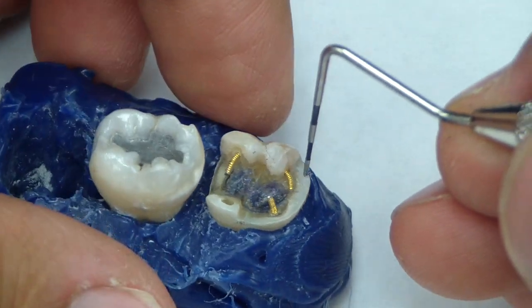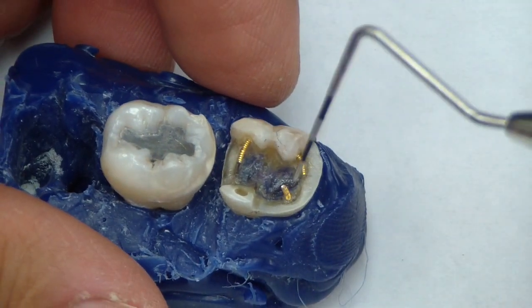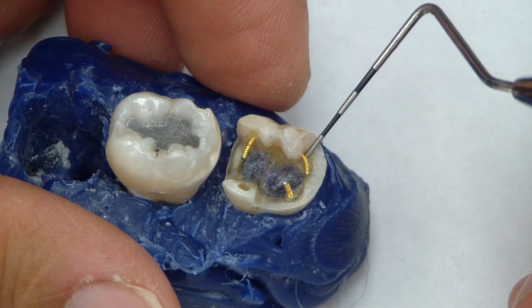You can also place some grooves — a whole bunch of different retentive features that can be placed. We're going to place amalgam bonds as well, bonding this in to cover that complex amalgam preparation.